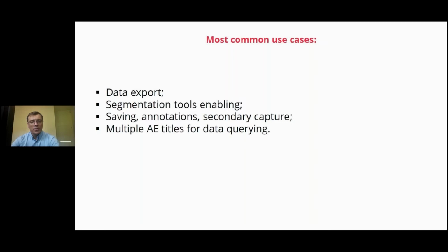It's not so easy. It's still the first time for us. It worked very well in our project, but you need to know that these capabilities exist, and if you face some problems, please contact our integration team or myself, and we will try to explain how to use it and whether this feature would give you value. But at our point, it was a significant change when we implemented this functionality.